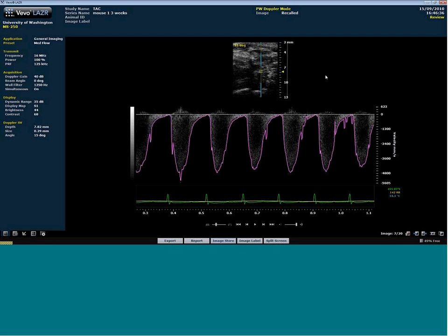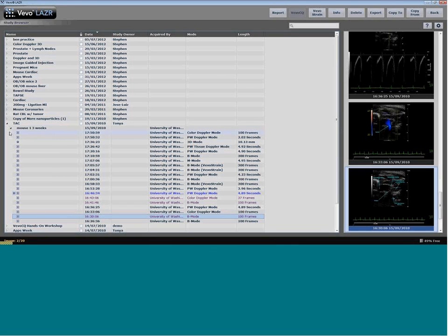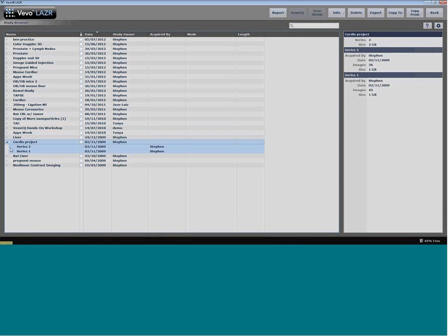So one other point I'd add, there's actually another transducer called the MS250S, which is specifically optimized for shallow imaging at 20 megahertz. So that's, again, a nice way of looking with a bit better resolution at lower frequencies to give those high velocity maximums. So just to clarify, we will email the document out to the listener that was asking about the maximum velocity. If anyone else is interested in that, please let us know with a quick email.